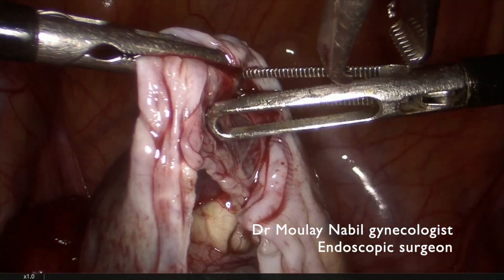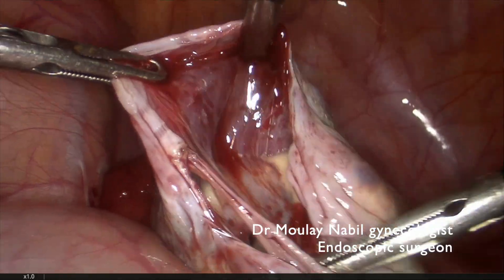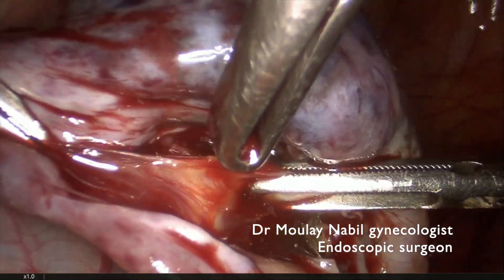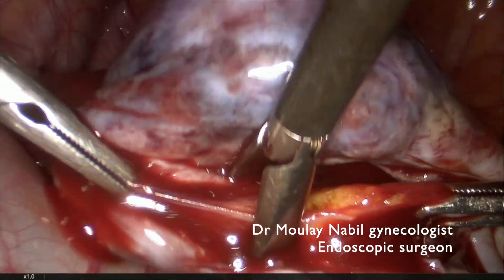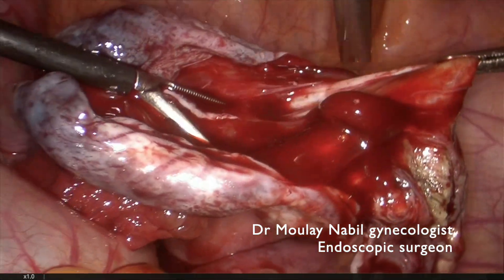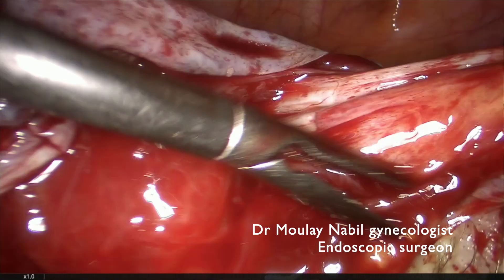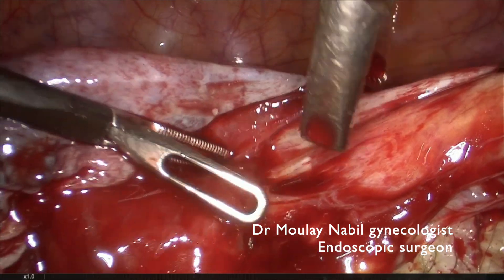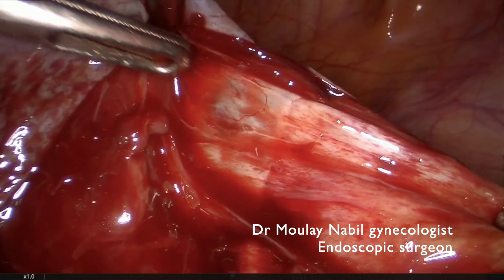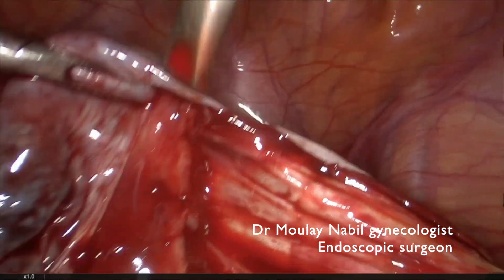The procedure is done by a movement of traction and counter-traction that allows us to remove the cyst from the healthy ovary. Even if there is a small bleeder, we recommend avoiding the use of any energy source for complete respect of the ovarian reserve, which is very important in this young patient.